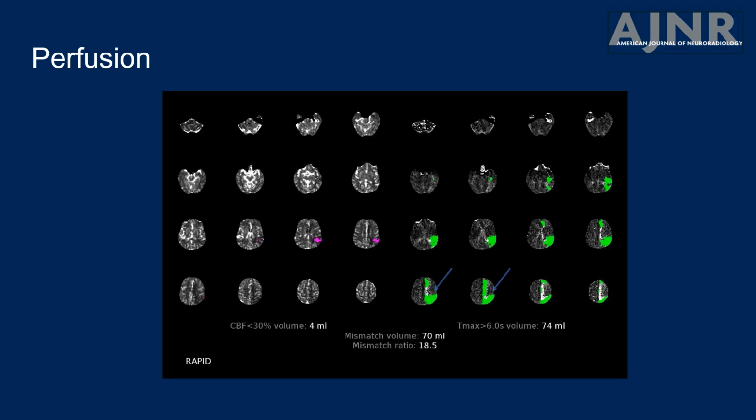And usually with a modern CT scanner, CTP and CTA can often be performed simultaneously with a single contrast dose, but in many centers they're still done with two separate infusions.